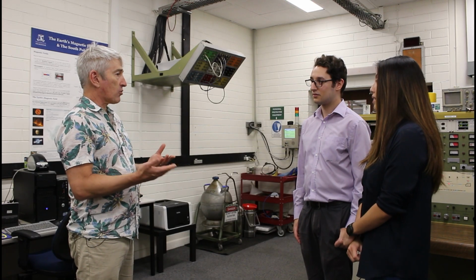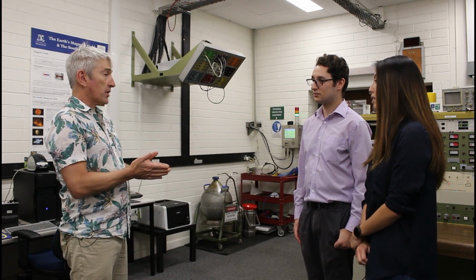So there's already particle beams in place, right? So what are you doing differently? So not everywhere has proton beam therapy. There's about 150 places around the world, and the entire process is quite slow. So we are basically trying to speed up the delivery of particle beams so that we can treat faster, and in turn that makes it more effective.